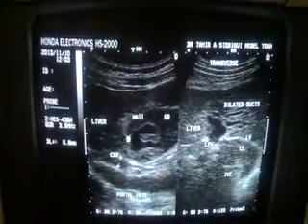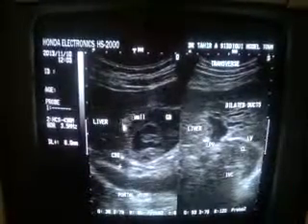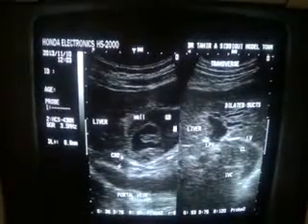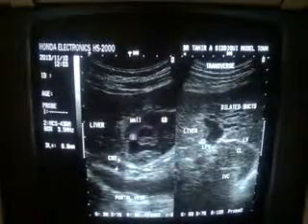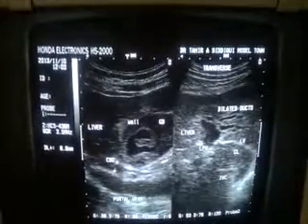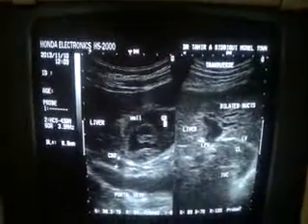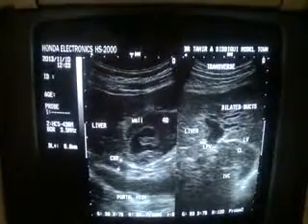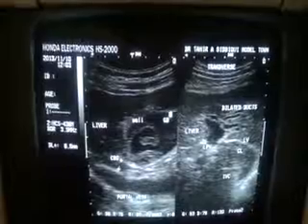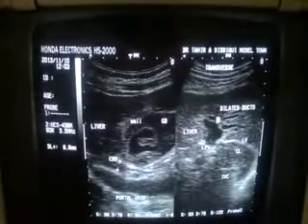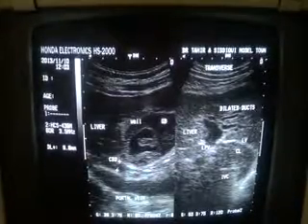This is the gallbladder. Note the wall of the gallbladder — the wall is variably thin and thick. It is thin in this region and thick at the anterior wall. Internally, you will see a lot of fixed thick debris along with layered echogenic material within the gallbladder lumen that is non-mobile. Because of the pressure from this material and the gallbladder pathology, the findings are in the very initial stage of development.